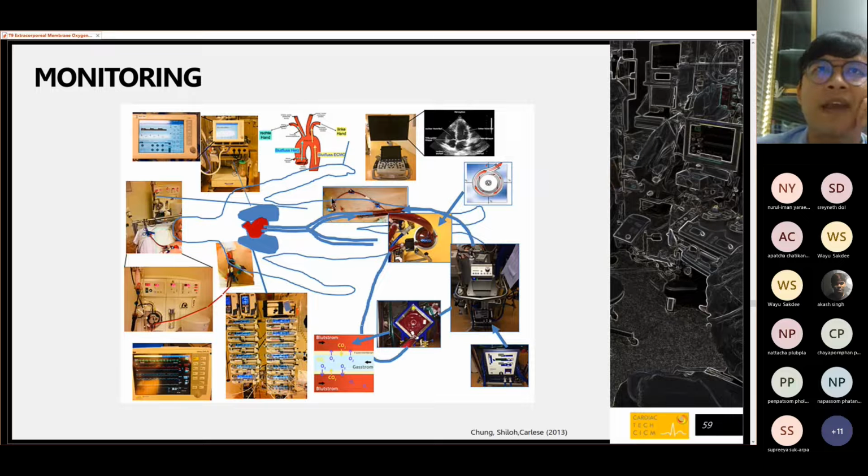On the other side, if we have no this catheter, it's going to obstruct the flow, right? It's possible to cause limb ischemia. To preserve the limb perfusion, we need another catheter to provide the flow in this direction.